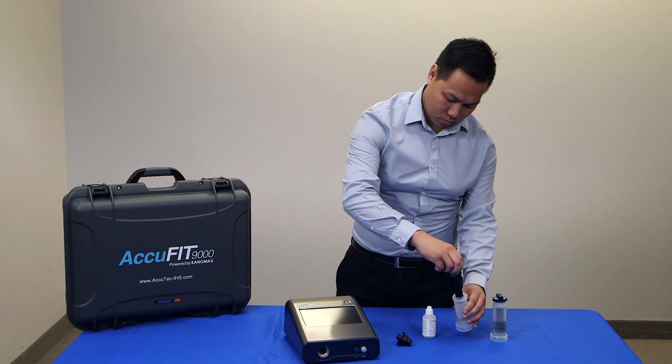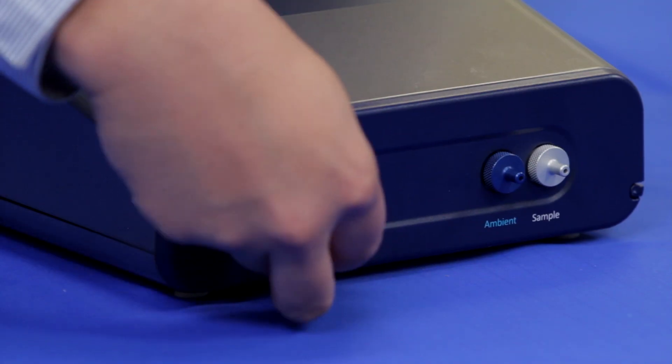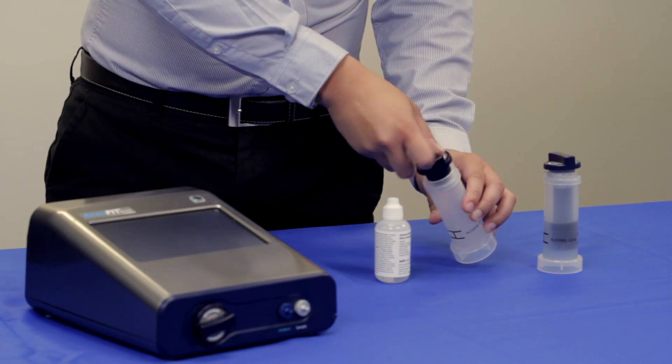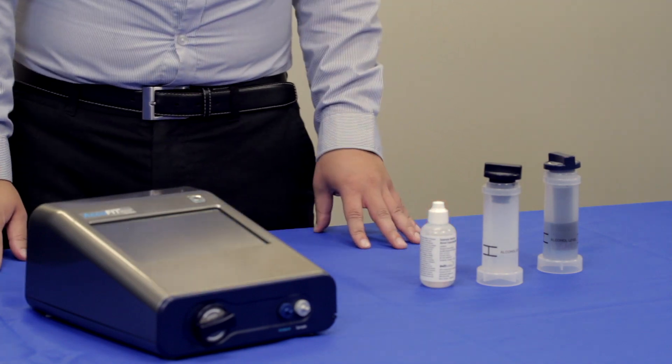Once recharged, remove the cartridge from the storage container and insert it into the AccuFit. Be sure to secure the storage cap to the alcohol storage container when the instrument is in use to prevent spills and ensure that the alcohol does not absorb moisture or evaporate.